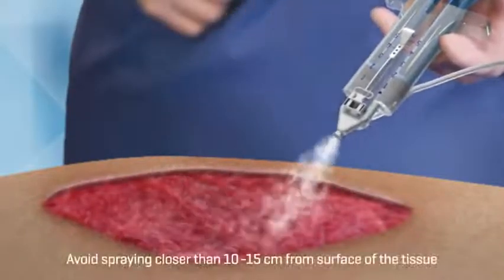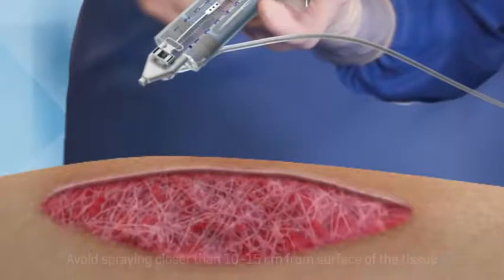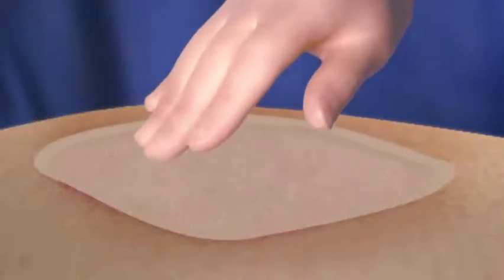Artis should only be applied in a thin layer. Excessive clot thickness may negatively interfere with the product's efficacy and the wound healing process. Immediately after Artis has been sprayed on the wound bed, approximate the wound areas or attach the skin graft.